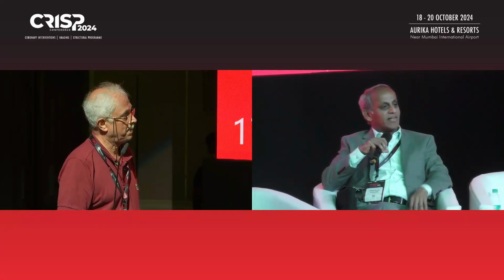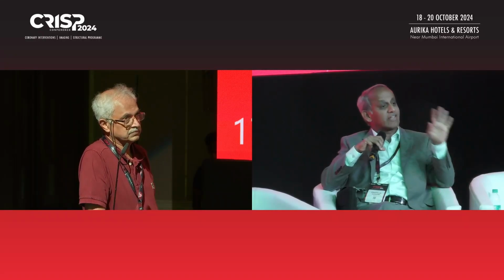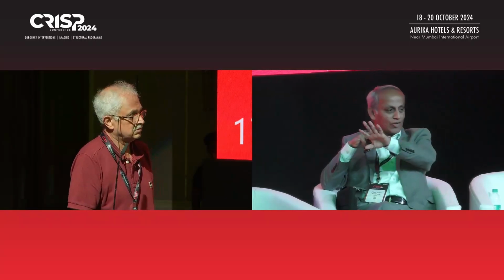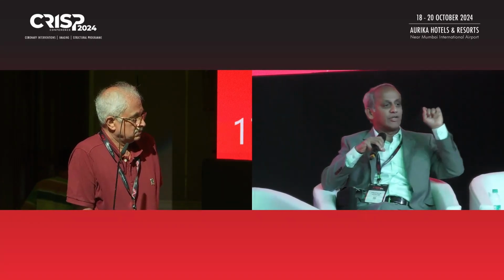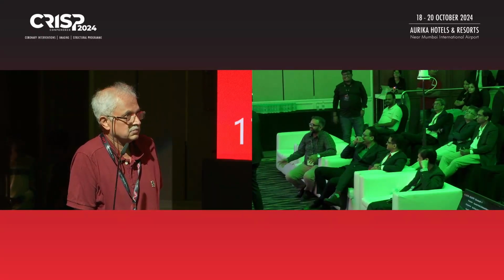So Rajiv, cause-effect wise, you prove first that there is a cause for that stroke. It's not cryptogenic, and that PFO is not an innocent bystander. I'm also for closing such. And those kind of PFOs, I don't think you get a dime a dozen. You understand?